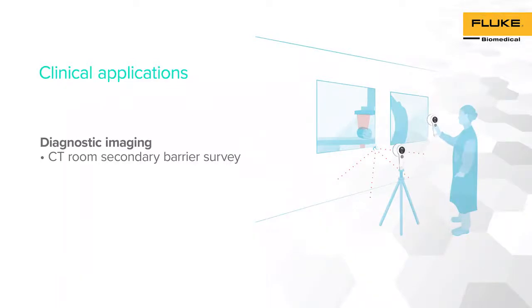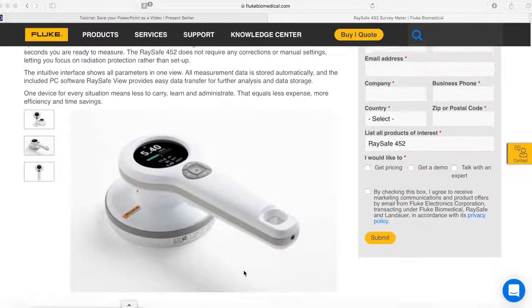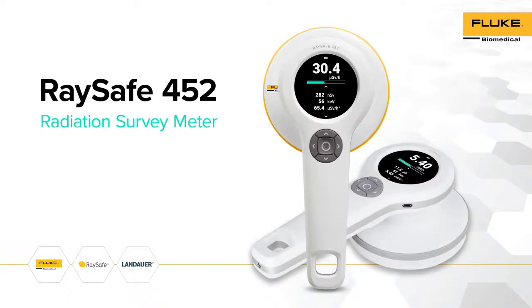The final demonstration consists of performing a CT room secondary barrier survey using RACE-A 452 as a radiation survey meter. For more information regarding RACE-A 452, please visit RACE-A's website, where you will find manuals, demos, and additional information regarding RACE-A 452 and its applications. Thank you for choosing RACE-A 452 — one device, endless possibilities.